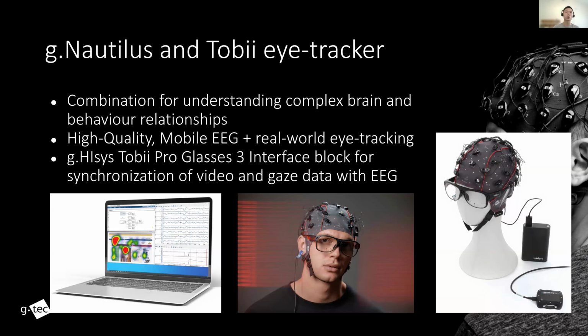Let's say you're doing robotic control. If the subject is focusing on certain control movement, let's say moving a car forward, you know that the subject is gazing at a forward control movement. So at the same time, you can co-match the signal data with the EEG data, making the BCI control more robust.